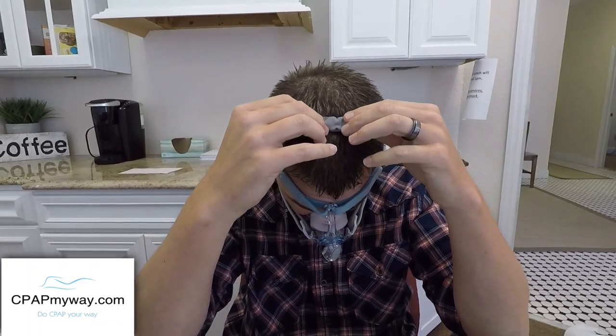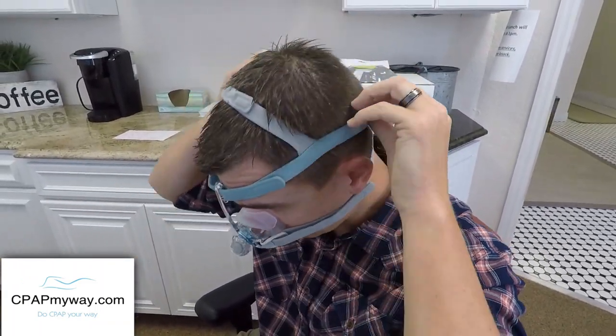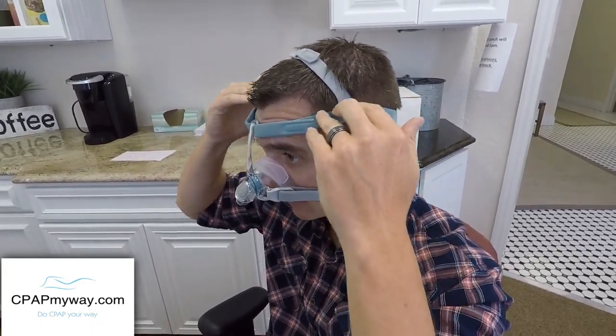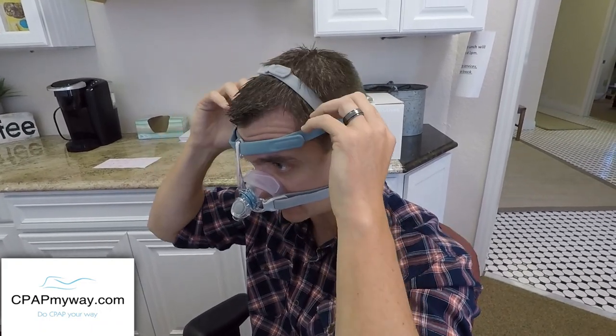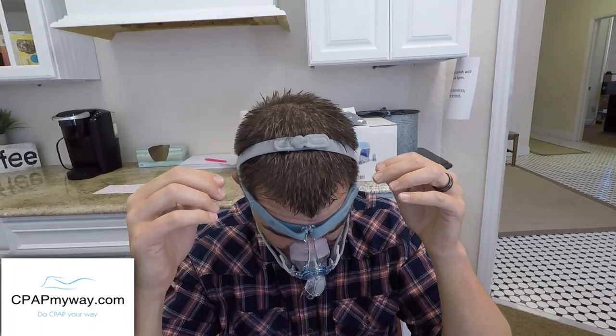On the top up here, I adjusted it in one, but you'll want to make sure that you adjust this so that the top part of the strap is kind of straight across your head here, so parallel, I guess you'd say. If it's too far down, near your ears, then you would adjust it up by tightening that on the top, which I did. It's got two settings there. All right. Let's hook it up and fire it up.